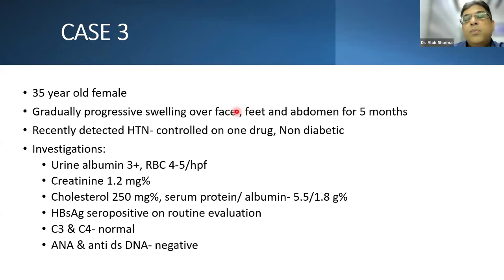Okay. So it is important. Similarly, there is another scenario which I'm sure the question was aimed at. You have 10 glomeruli, 7 are showing sclerosis, segmental sclerosis. Still call it segmental sclerosis. Maybe you can omit that focal if you want to.